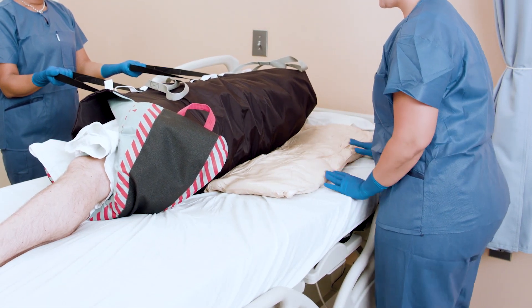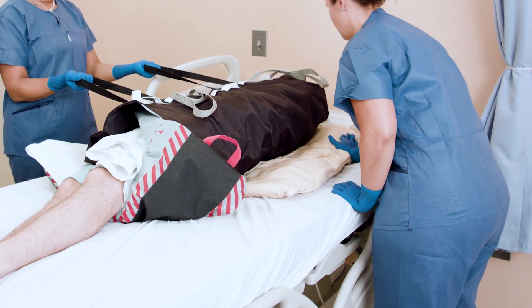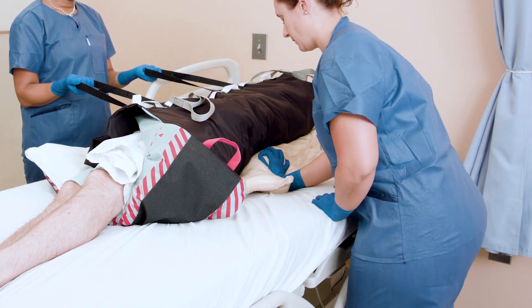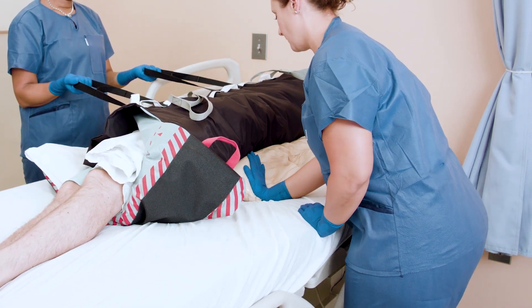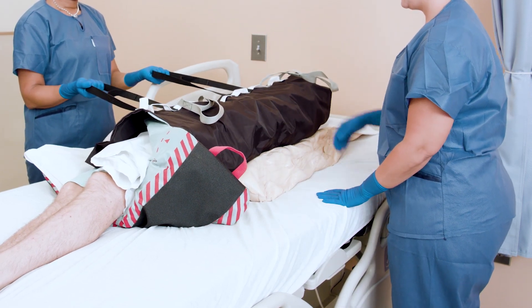Start with the positioner flat and just above the sacral area. Have the patient lean back into the positioner. Then use the flat part of your hand to mold the positioner next to the curvatures of the body, using three to four smooth movements until the desired degree of turn is achieved.